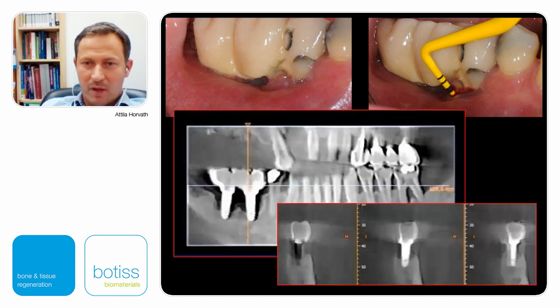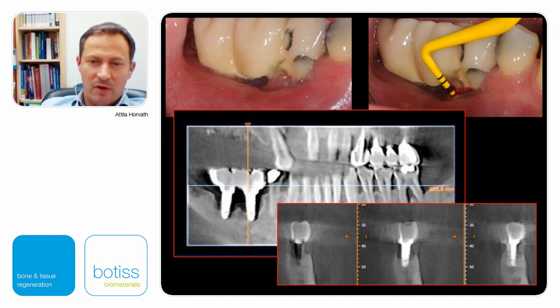an implant. So then the patient already came with a CT scan, and unfortunately on this CT scan we could see these two structures under this, whatever we call it, bridge, maybe just a hat or whatever.